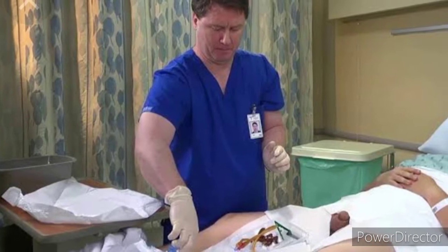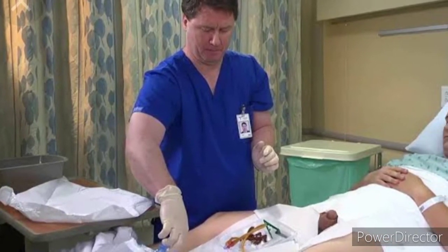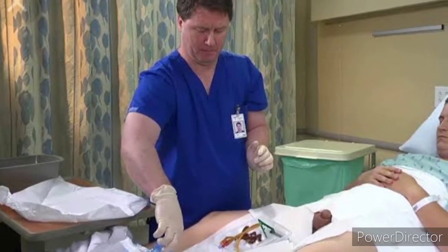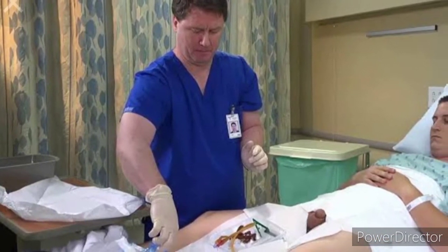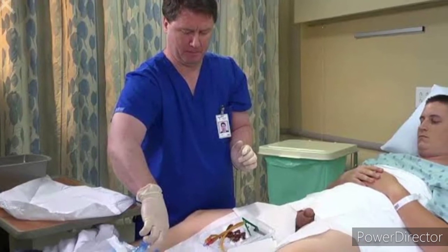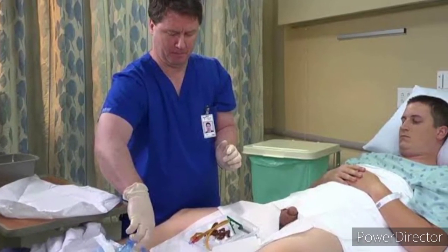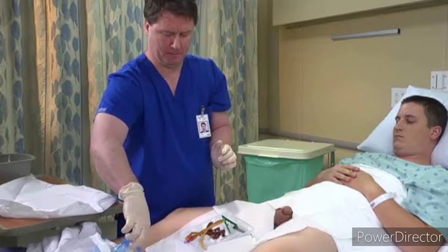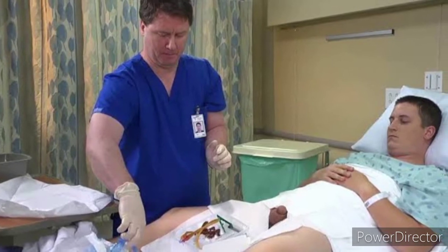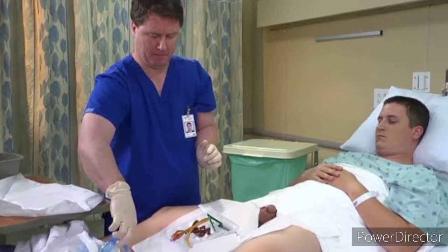For a male patient, provide the supine position. Drape the patient so that only the area around the penis is exposed. Then place the catheter set next to the leg of the patient.